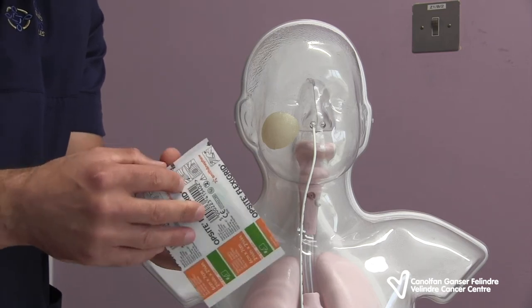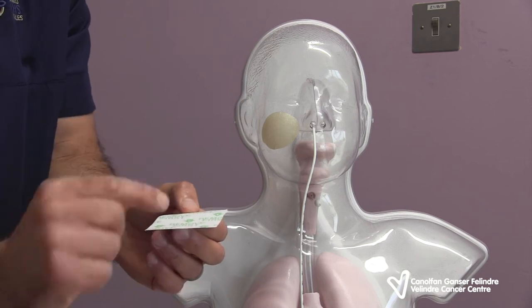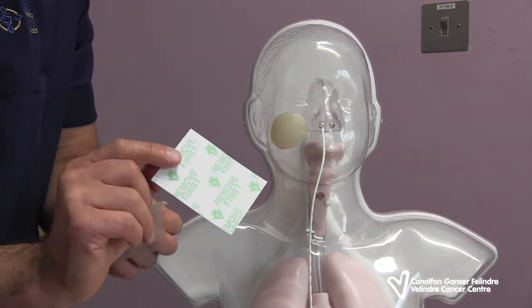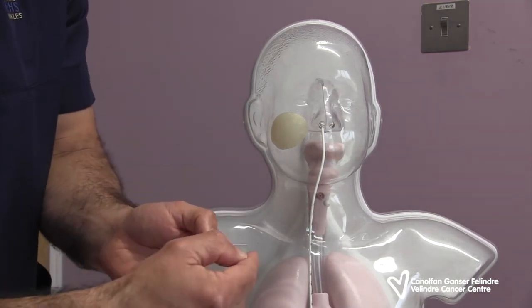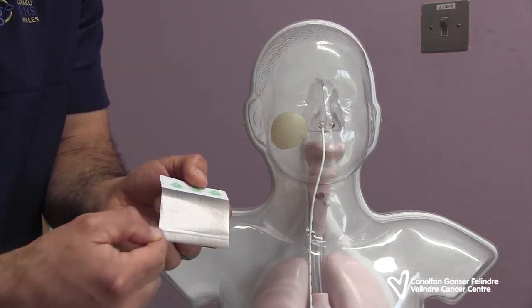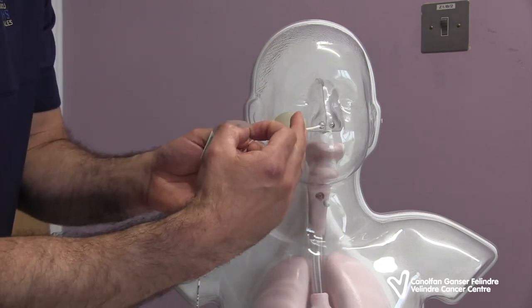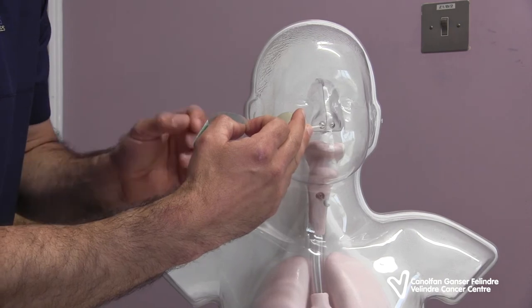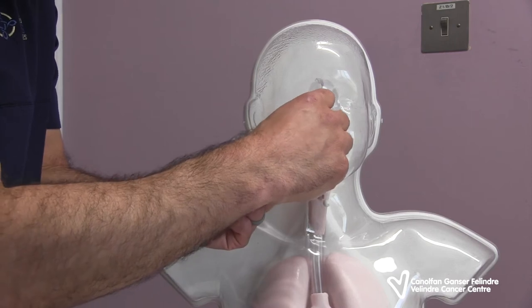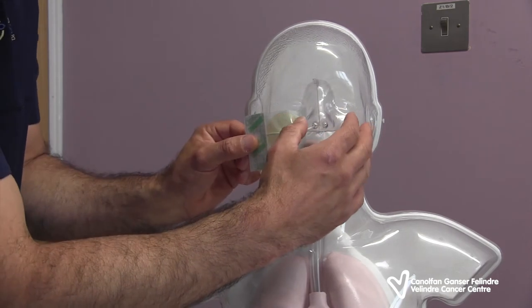With the Opsite Flexigrid, open that packaging. You have three sort of labels. You remove the first label, as stated on the packaging. You'll notice that the sticky edge doesn't start right at the end of the dressing itself. So that edge, you want that as close to the nose as you possibly can. You can also cut these down to size. They don't have to be as large as this. So get that as close to the nasal edge as you possibly can, and secure that down.